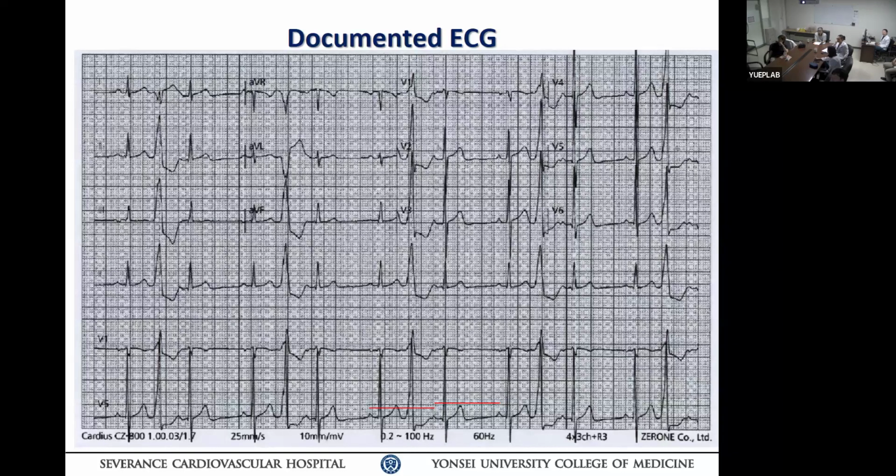One of the cases we did had a two French catheter in the cardiac vein and the septal vein insertion. The very first branch of the cardiac vein, picking it up for the septum, would be very helpful. You're going to see a very early double potential, a very sharp potential. Hopefully one day I can show you. I have an organized case here. That is an important target to know where to apply.